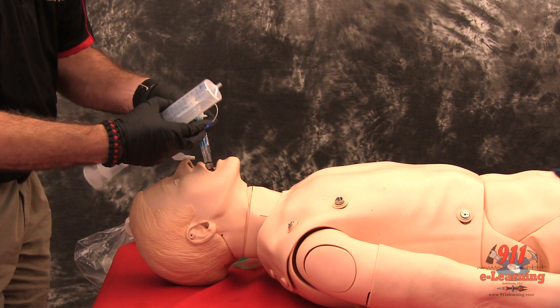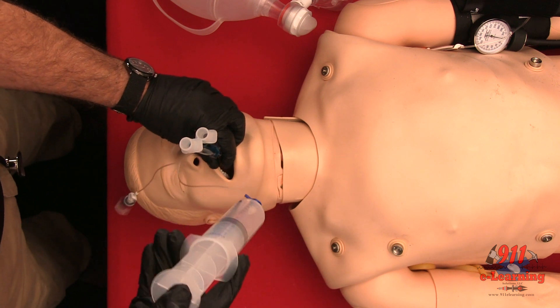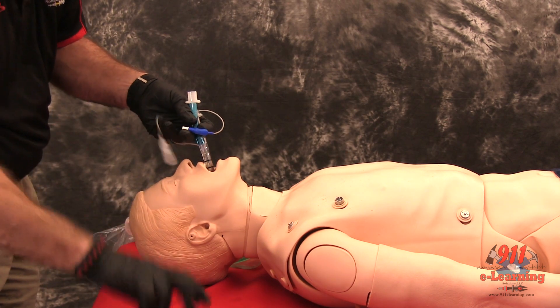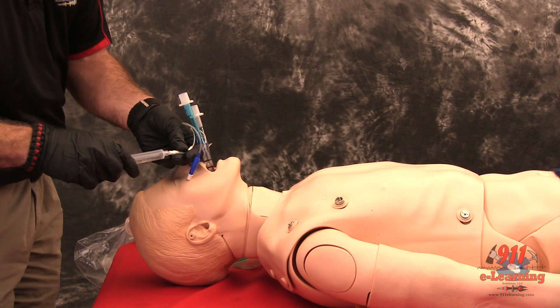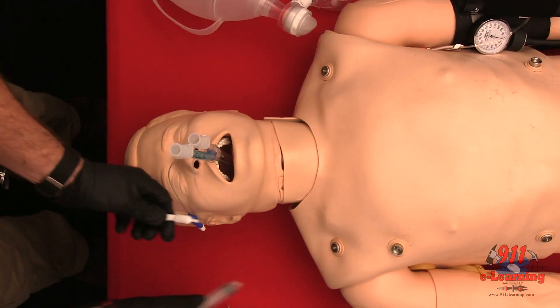Inflate Line 1, the Blue Pilot Balloon, leading to the pharyngeal cuff with 100 cc's of air. Inflate Line 2, the White Pilot Balloon, leading to the distal cuff with 15 cc's of air.